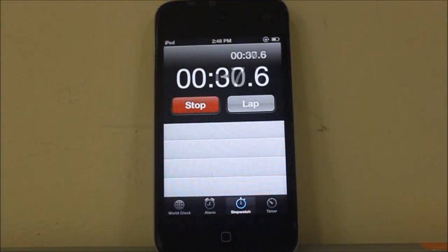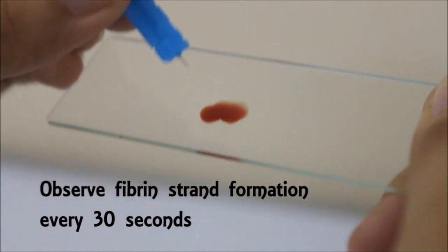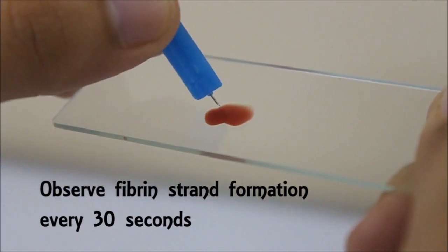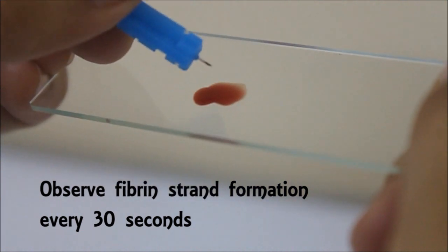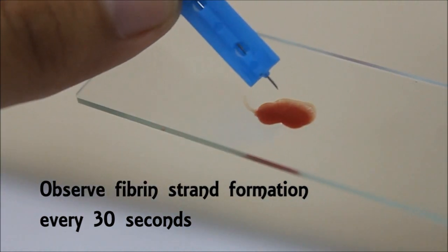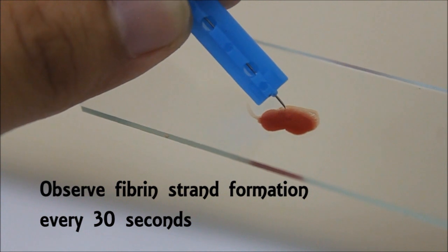At 30-second intervals, let a needle or lancet pass through the blood drop. See to it that you move the needle or lancet upward very gently. Observe for the formation of the first fibrin strand.